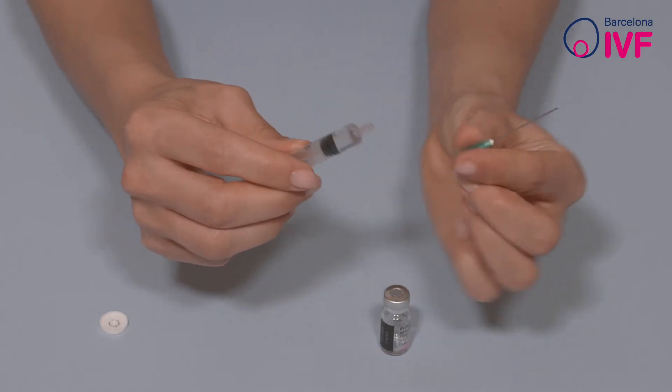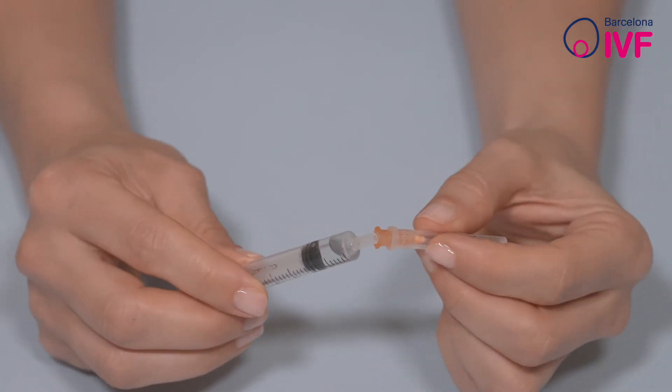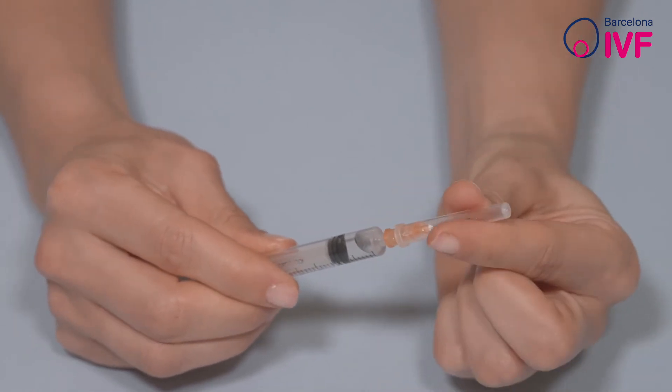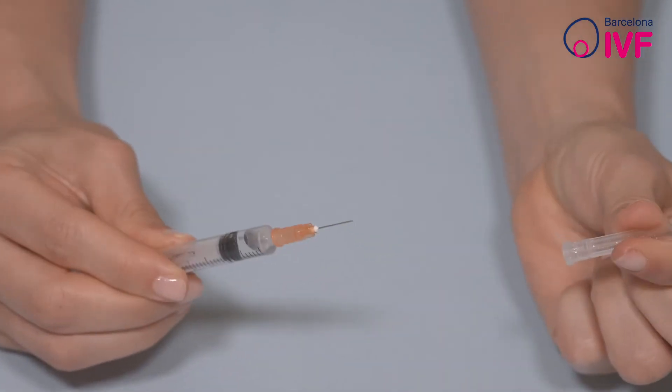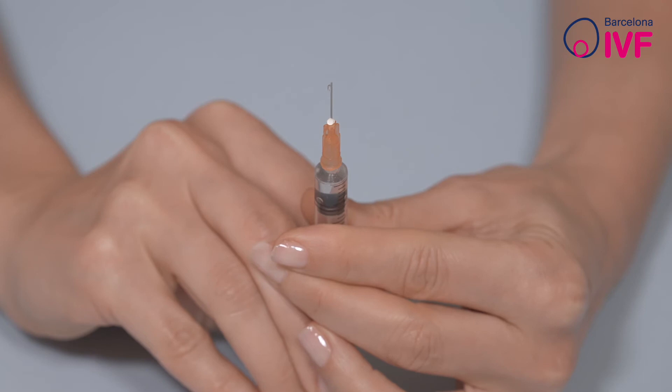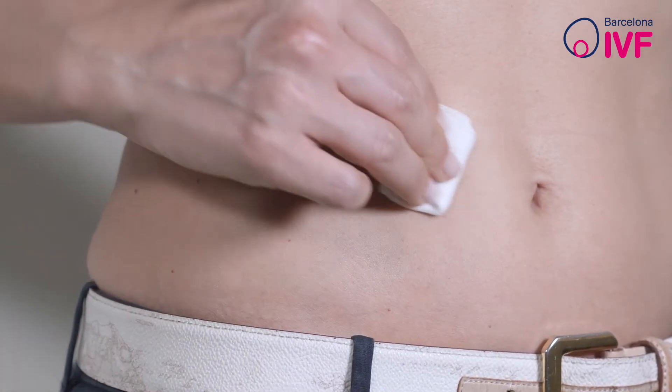Remove the large intramuscular needle and change it to the smaller one for subcutaneous injection. Remove the needle guard. Push the plunger a little to bleed the needle until a droplet comes out. Everything is now ready for administration.